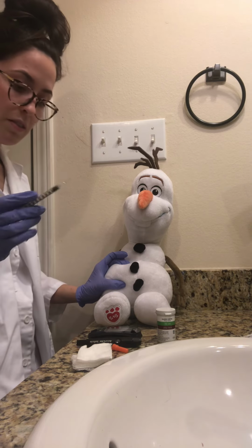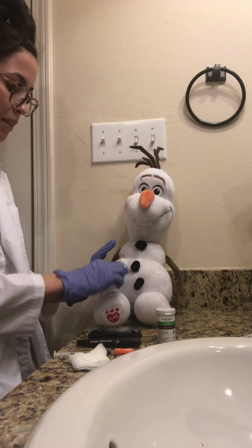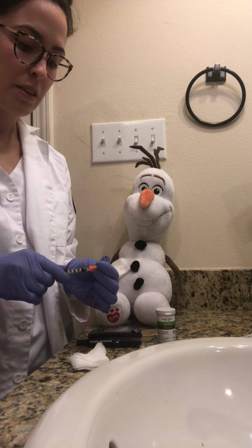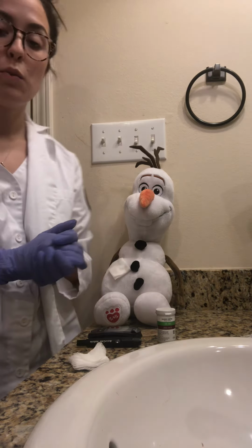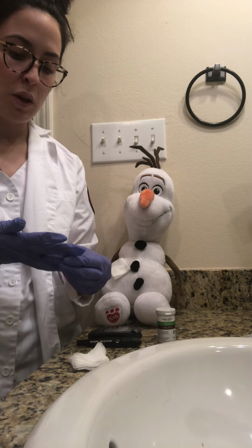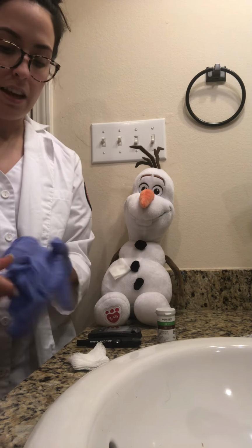All right. And then you're going to put this in the orange cap here. Give him some gauze just in case of any kind of bleeding or leaking. And then the very next thing you're going to do is make sure that cap's on there and safely dispose of the needle. And once I'm done with that, I'm going to doff my gloves, perform more hand hygiene, and document that the medication was given to the patient. And that'll be it.